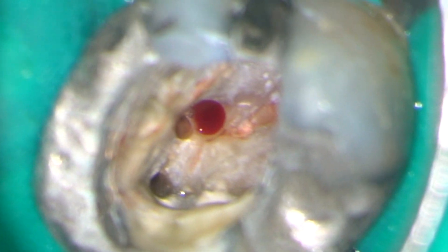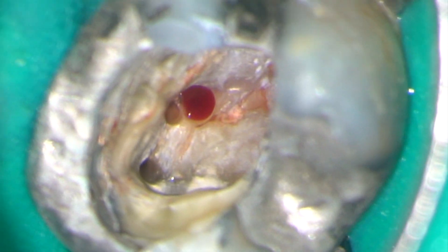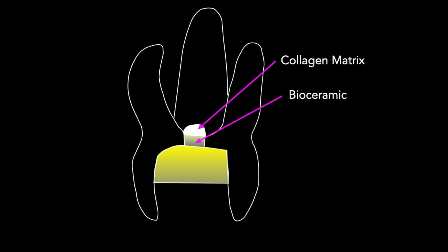Under high microscopic magnification you can see that the perforation site is now bleeding. We can now carry on to repair the perforation. In the first instance I'm going to pack a collagen matrix through the perforation hole and into the bony crypt. This can be a material such as haemocollagen. Onto the matrix you can pack a bioceramic, biodentine or MTA, and finally restore the access cavity with a restorative material.